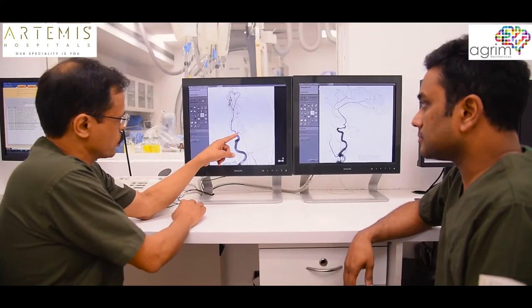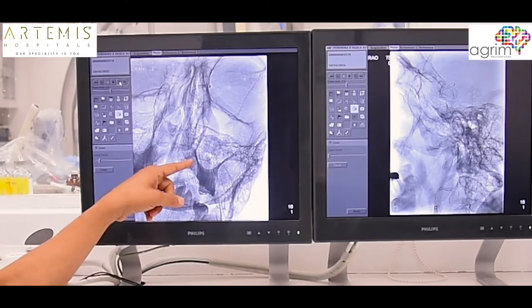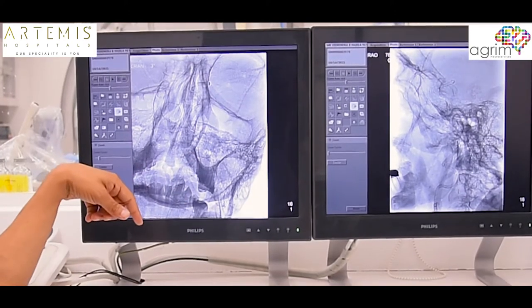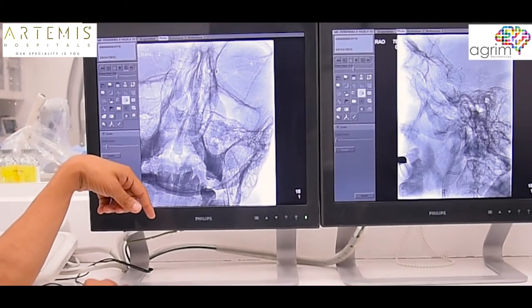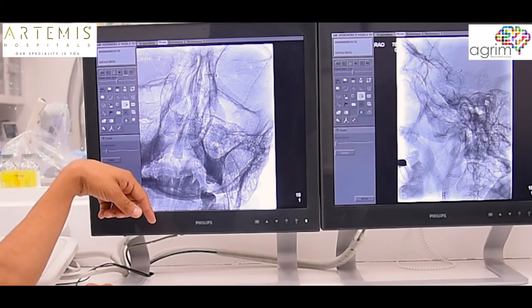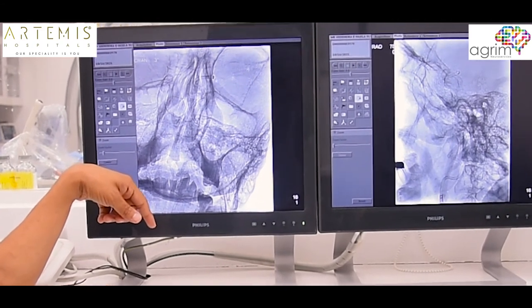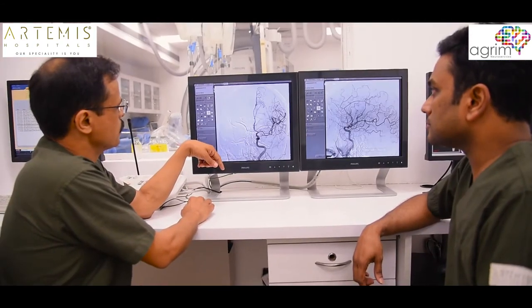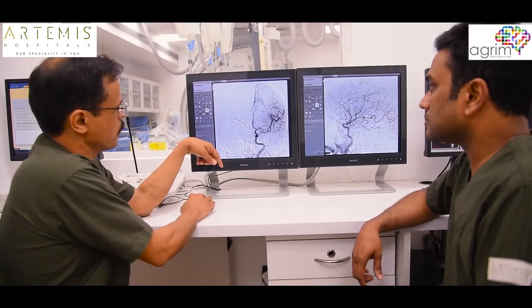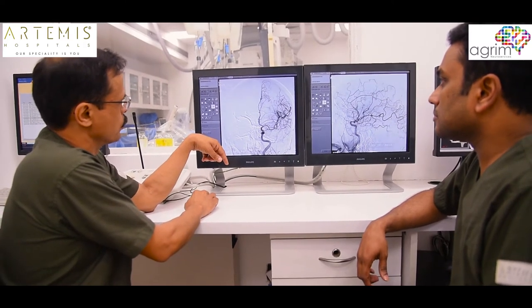This blood vessel was blocked here, and through the leg blood vessel we took this tube known as an aspiration catheter. This shows the stent retriever device which was placed there, then it was taken out and the normal blood supply was restored.